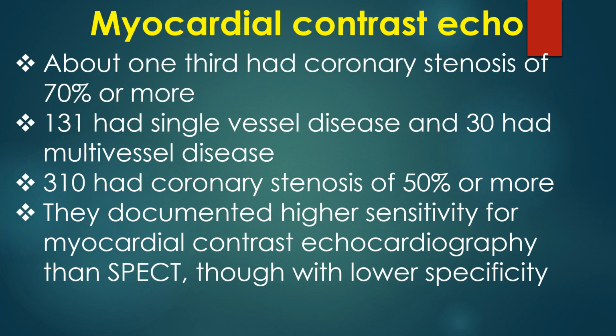About one-third had coronary stenosis of 70% or more. 131 had single vessel disease and 30 had multi-vessel disease. 310 had coronary stenosis of 50% or more. They documented higher sensitivity for myocardial contrast echocardiography than SPECT, though with lower specificity.